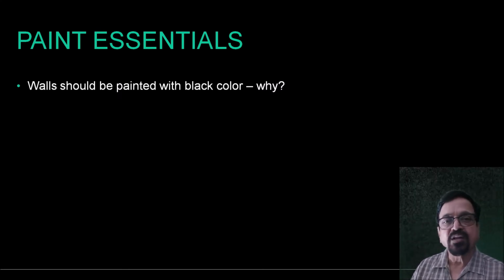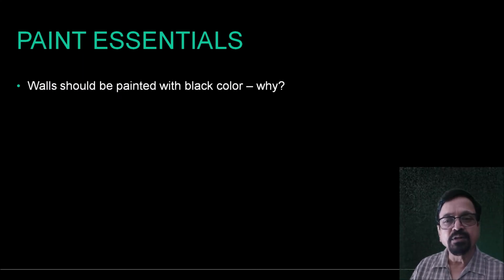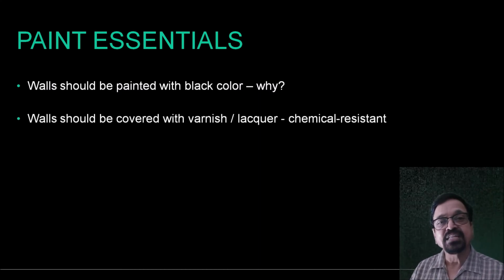There might be a small leak from the walls, from the pass box, from the safe light, or from any other sources like exhaust fans. So if the light comes inside and falls on, suppose, a white surface, it will get reflected. That is something which we don't want. So for that reason, a darkroom is preferably colored black. But if it is painted with black, then the visibility inside is really difficult even with the help of safe light.